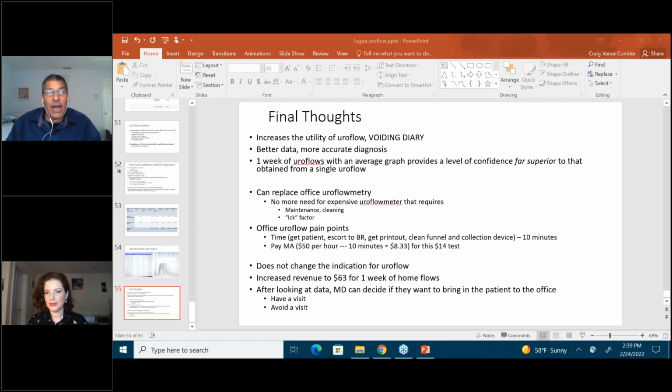As far as women goes, right now, it is not designed to measure flow in women because it needs the splash, and it's been validated and programmed to do the splash of someone who's standing up. But I do know that BE Technologies is working on this to be in women. It's the logical next step, and I don't think it's very difficult technology. It's just a matter of getting the mic either down there in the toilet or having it more sensitive so that it can hear it.